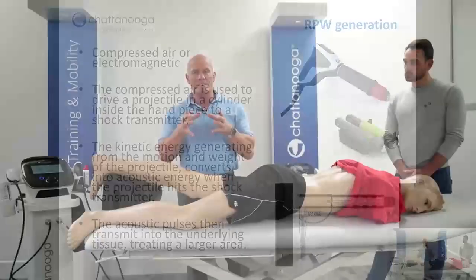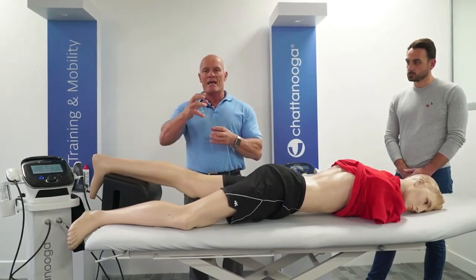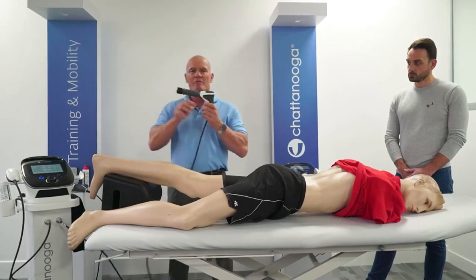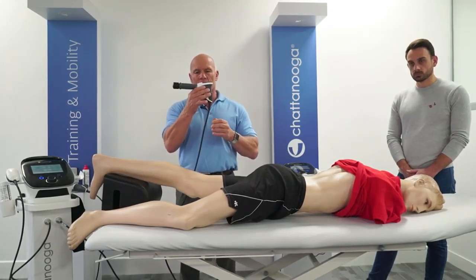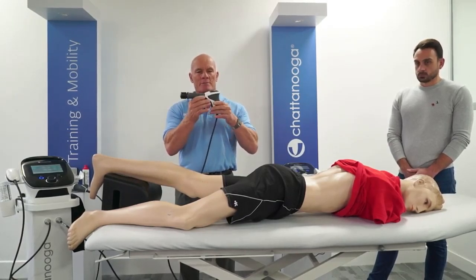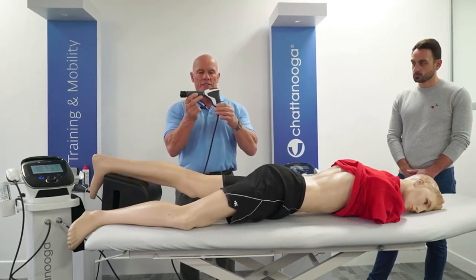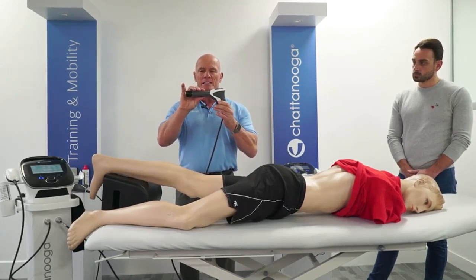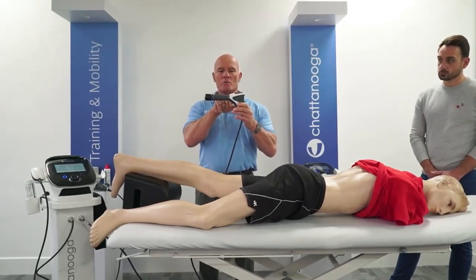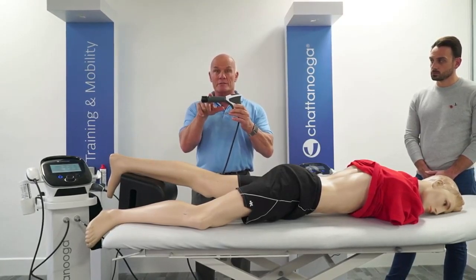Now how this works is that we have a compressor which produces compressed air which is released into a handpiece through some very clever valve technology. And depending on your manufacturer, this can open between 15 and 21 times. So on the new Chattanooga Falcon handpiece, the valve technology can allow air into the barrel 21 times per second, allowing the projectile, which is in the tube, to travel up and down 21 times per second.